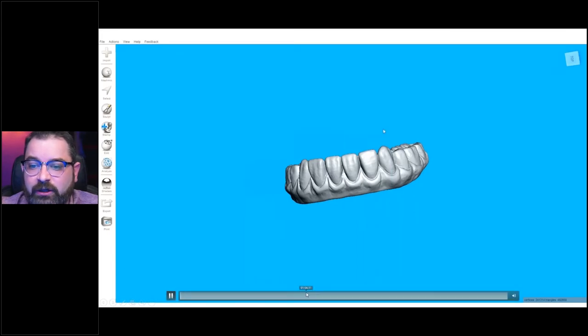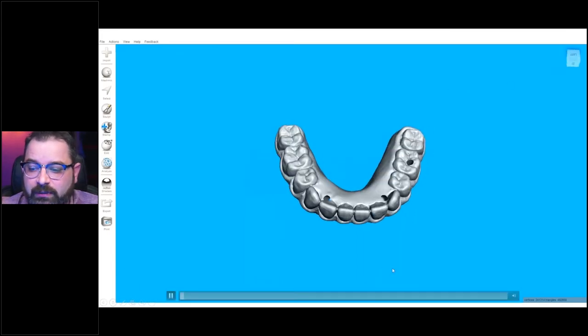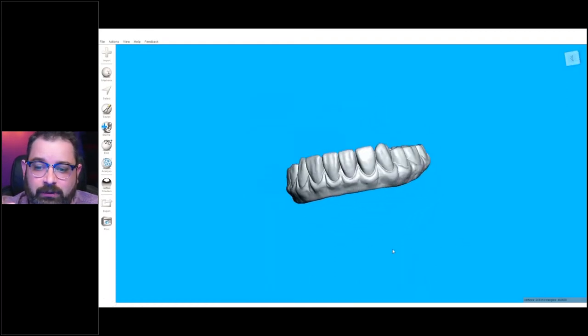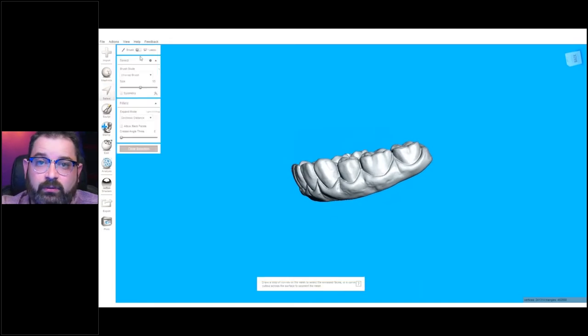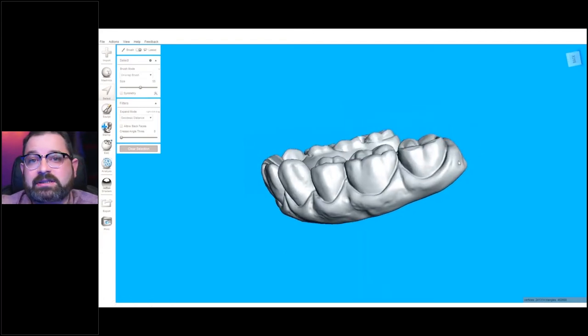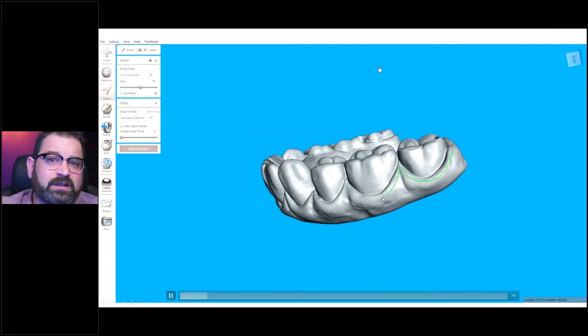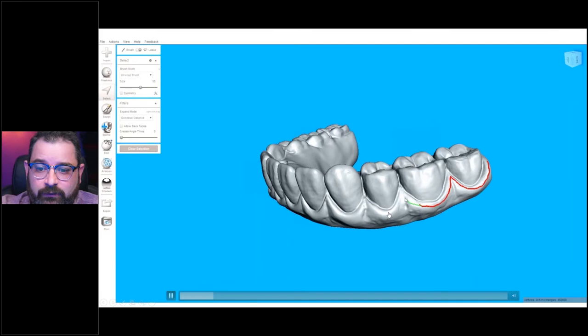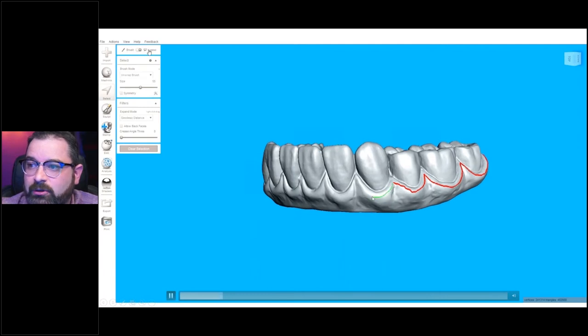I've made a little video that I'm going to fast forward through in some areas. This was an actual hybrid case that was going to be picked up later on a Ti basis. The restoration was designed — I actually did the setup by hand and then simply scanned in the restoration with my desktop scanner. Here I'm utilizing Mesh Mixer software, which is a free software you can download from the internet. I'm uploading the STL file that I've exported from my scanning software and choosing the lasso mode selection.